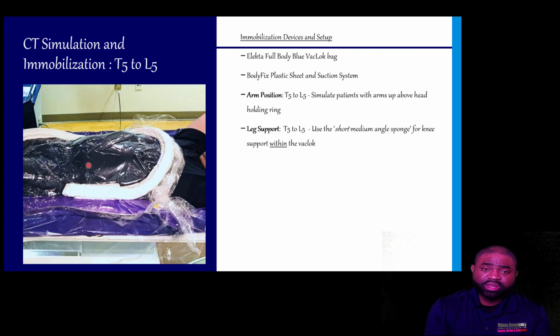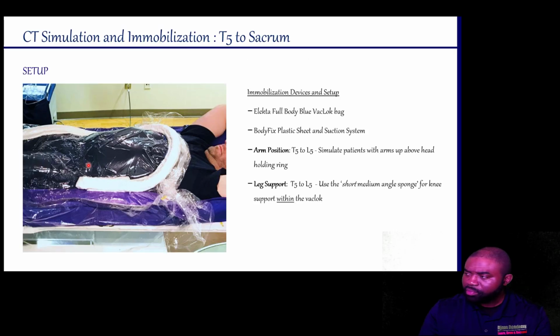And by the way, if we can move the arms out of the beam, we just want to irradiate as little healthy tissue as possible. Our objective here really is to hit the target as hard as we can, as well as to spare the surrounding organs at risk.